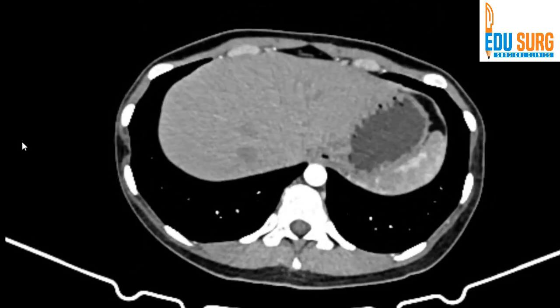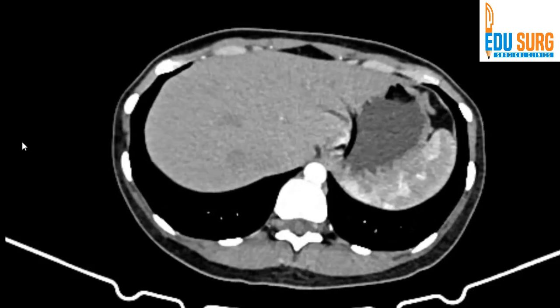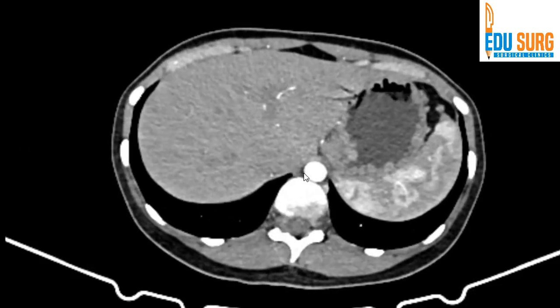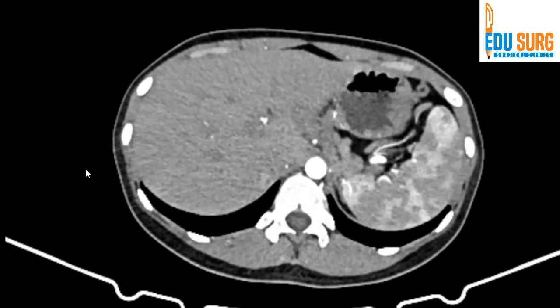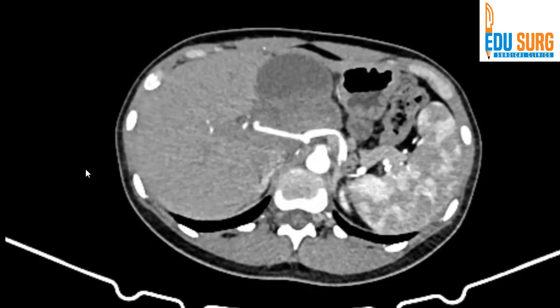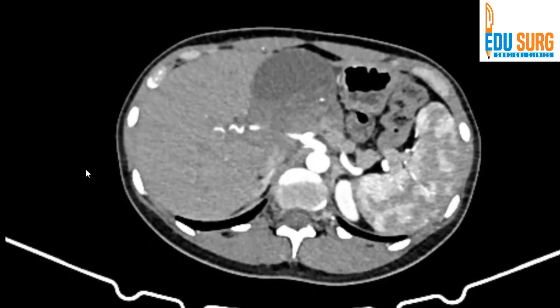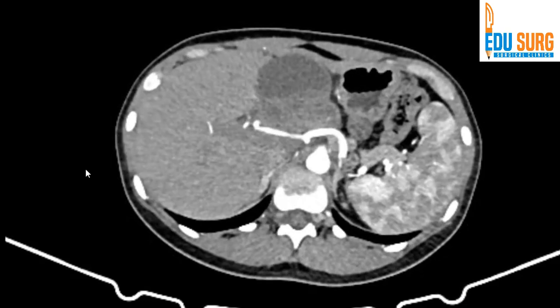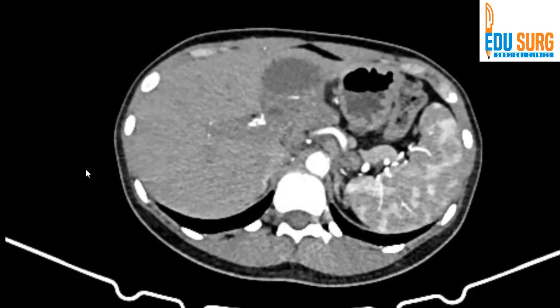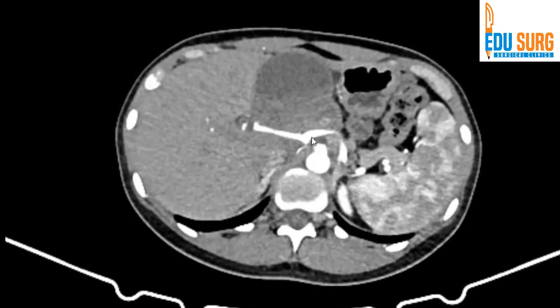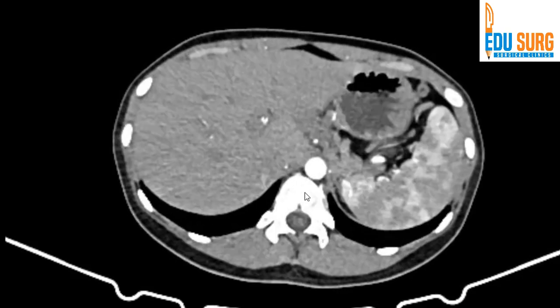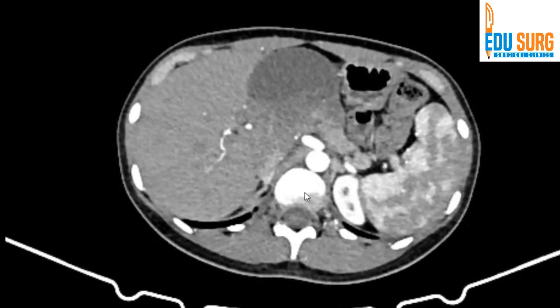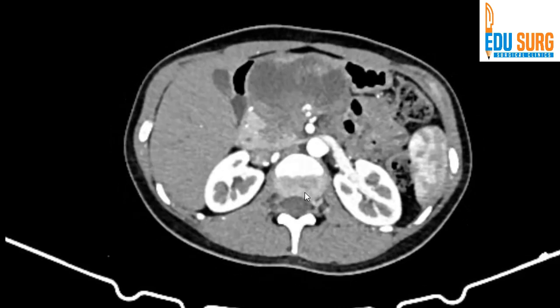This is the first axial series — this is an arterial phase image. You can see the aorta is white. By now you know how to identify the different phases; if not, we have a lot of videos on basics of scan that you can look at. You can see the anatomy: this is the celiac artery, the common hepatic artery, and the splenic artery. The hepatic arterial anatomy is normal.